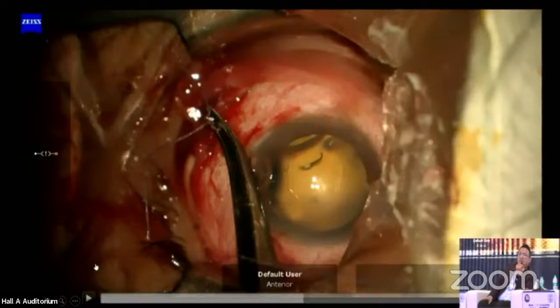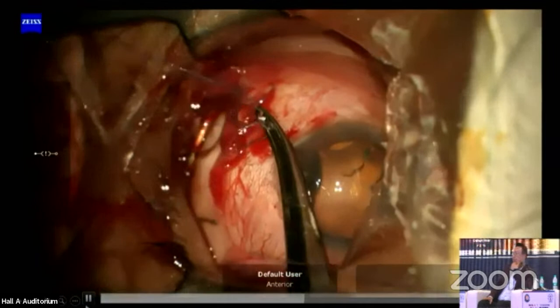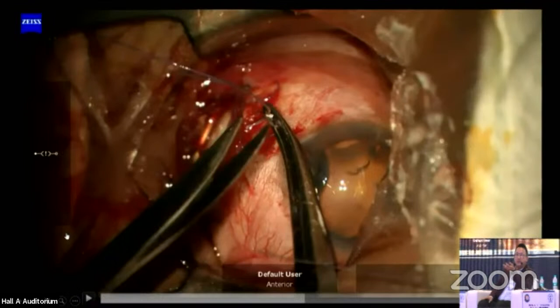Yes, like he rightly said, this is very important. And as I mentioned, this is not always needed for every kind of plaque surgery. It depends on the location of the tumor. Sometimes you can easily pass the plaque between two muscles and you really don't have to disinsert. But this is one particular case where the tumor was temporal, and therefore we had to do this procedure on the lateral rectus. Sometimes you have to disinsert or resect the oblique muscles also, when you have to go back quite far and there is obstruction by the oblique muscle. Sometimes you have to sacrifice and resect the oblique muscle also in order to position the plaque in the ideal location.